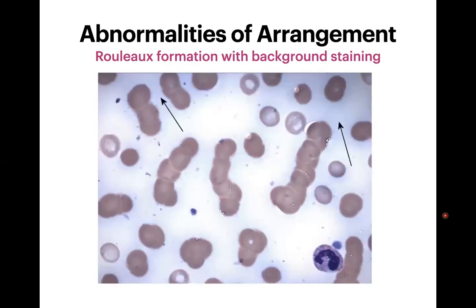This image is from a multiple myeloma patient. You can see RBCs arranged in a pile-of-coins shape, and there is a background that appears blue — characteristic of the high protein environment in myeloma.